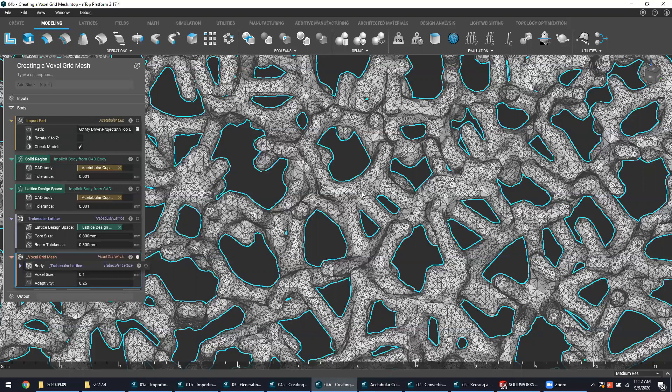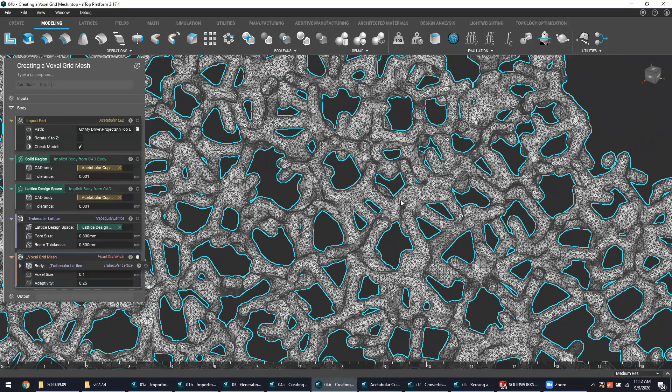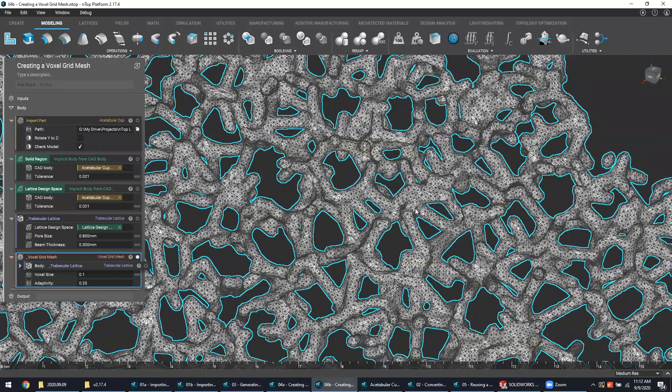The other detail you'll notice is that I have meshed just the lattice structure here and not the solid region. Some 3D printers have different sintering or melting profiles for different regions, solid versus lattice structures. So in those cases, it may be necessary to mesh the lattice structure and the solid region independently and provide those to your machine separately.